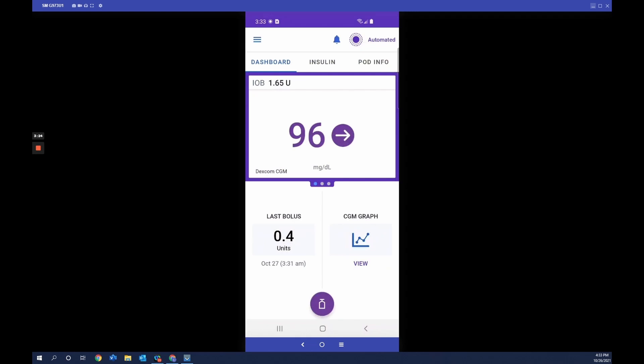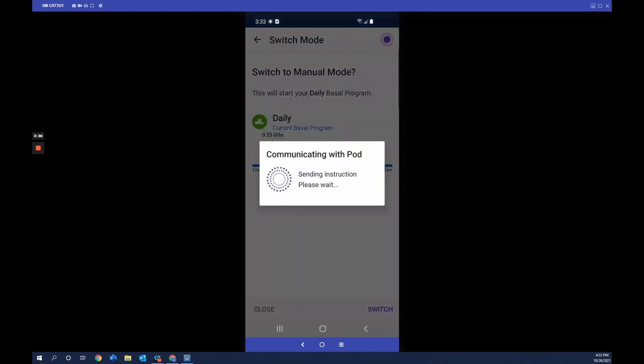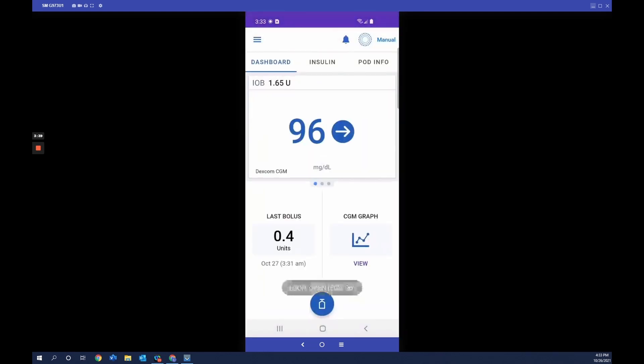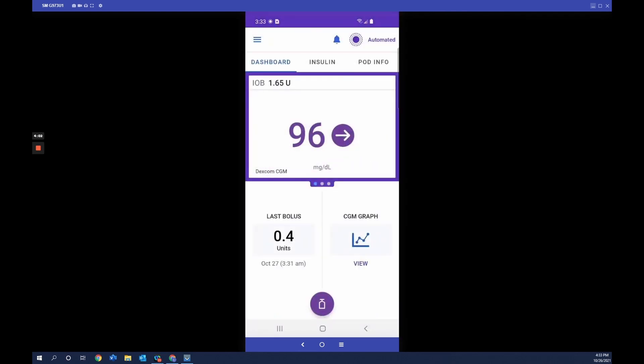Omnipod 5 can also be used in manual mode with or without a CGM connected. Tap the menu button, then tap Switch Mode, which displays the default basal program you initially set up. You'll notice the menu color changes from purple to blue, indicating manual mode in the top right corner. The CGM still communicates with the pod — it's just not informing the insulin dose every five minutes.